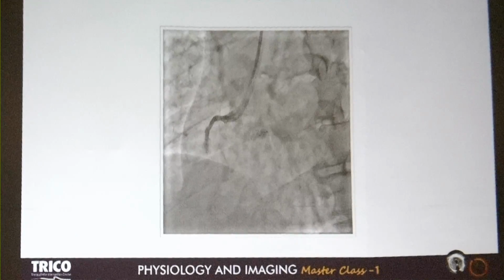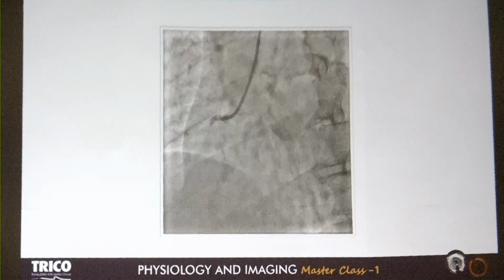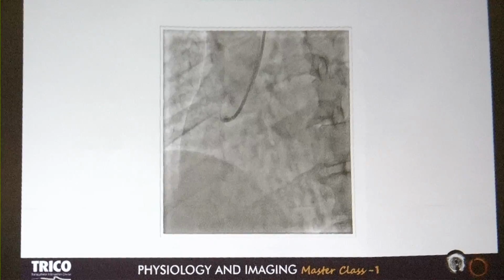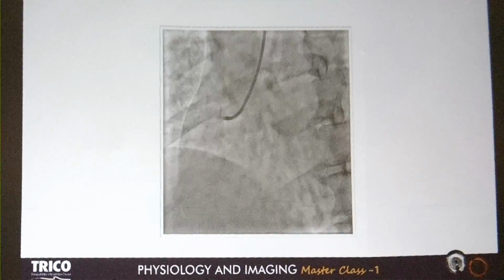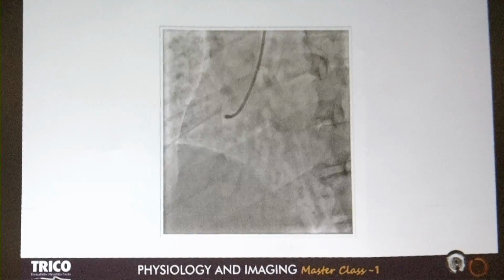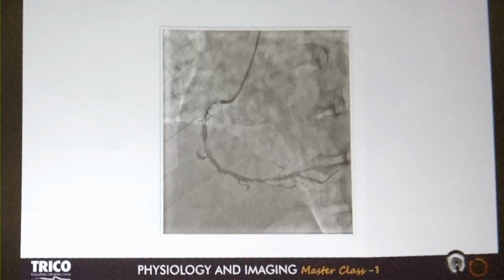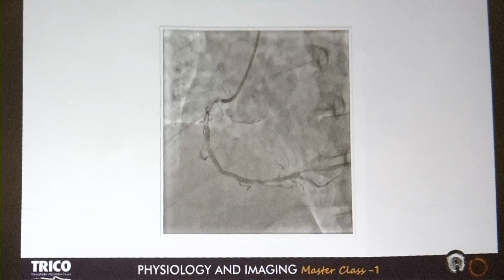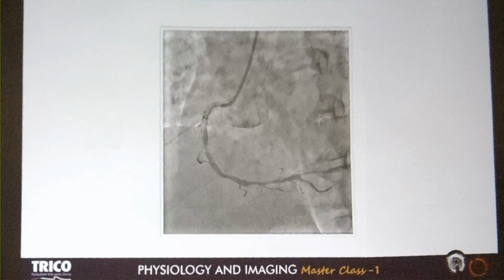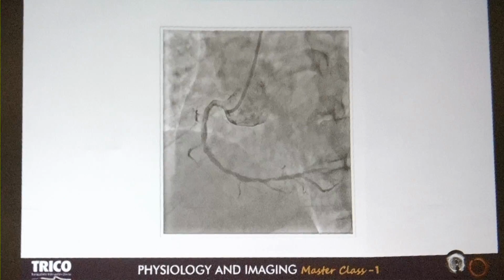Professor? Recanalized vessel might be. So then it should have gone in. Abhiram and Samir, either it's recanalized or it's a markedly calcified lesion. But if recanalized, then my wire should go, and my wire should go with balloon. Just distal to the lesion, if you see, the RCA does have certain edginess, honeycombing appearance. Concentrate on something abnormal in the area surrounding, distal to the lesion. It's the vasa vasorum which have opened up around the lesion.